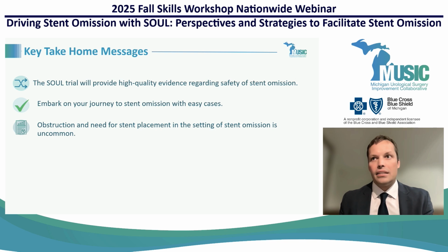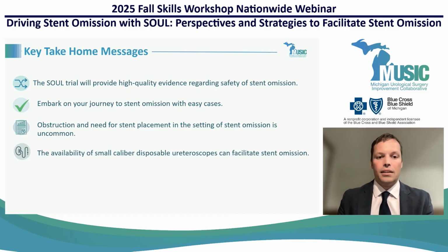But do realize, as you're going down this path, the data has suggested time and time again that while it is a fear or uncertainty, Anne said multiple times from our physician interviews, it is a lot of uncertainty, but it may be unfounded, right? Obstruction and need for stent placement in the setting of stent omission is very, very uncommon. In the MUSIC literature and in others, it's far less than 1% of the time. So take comfort in that fact, especially as you're using some of these more straightforward cases.